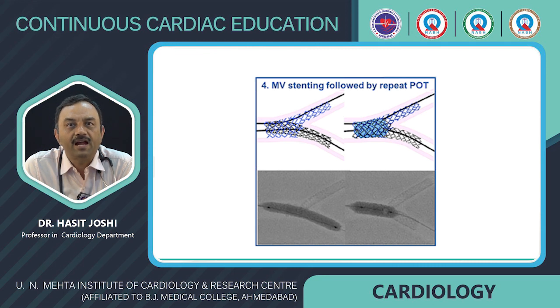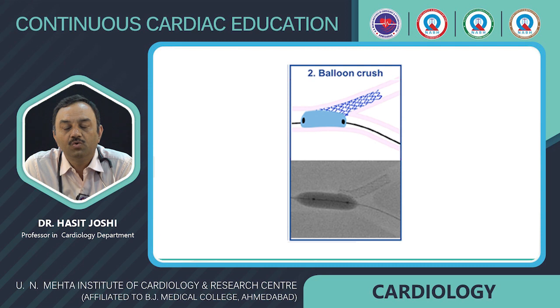Then you inflate the side branch stent at a nominal pressure, and then pull back a little and inflate it at higher pressure. After that, you remove the wire and balloon from the distal side branch and crush the stent with the balloon which was 1:1 with the distal main vessel.